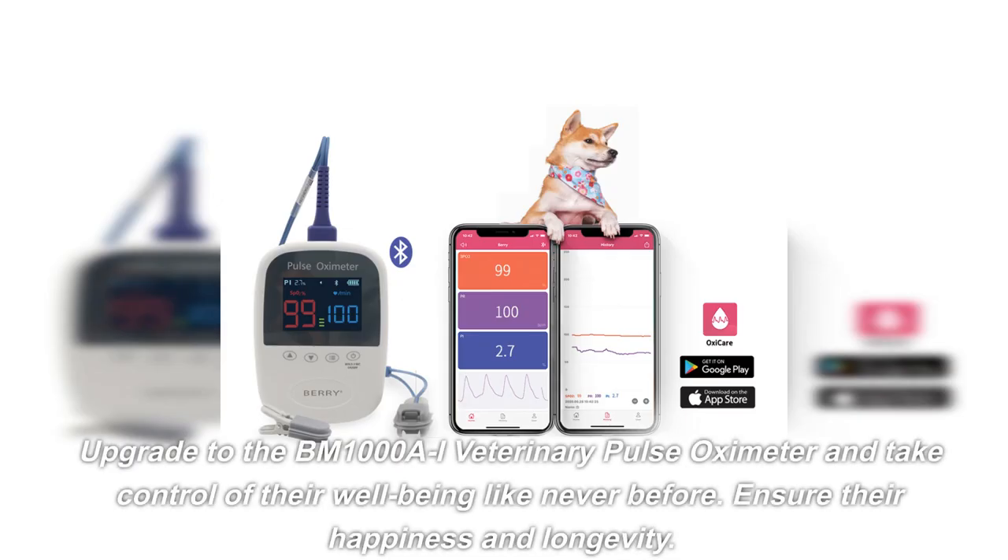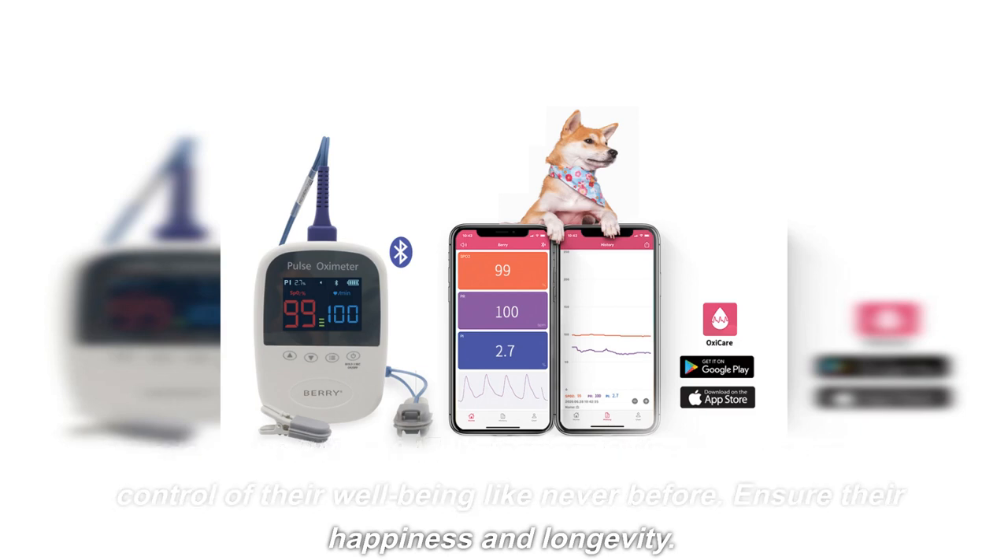Don't compromise on your pet's health monitoring. Upgrade to the BM1000AI Veterinary Pulse Oximeter and take control of their well-being like never before. Ensure their happiness and longevity.